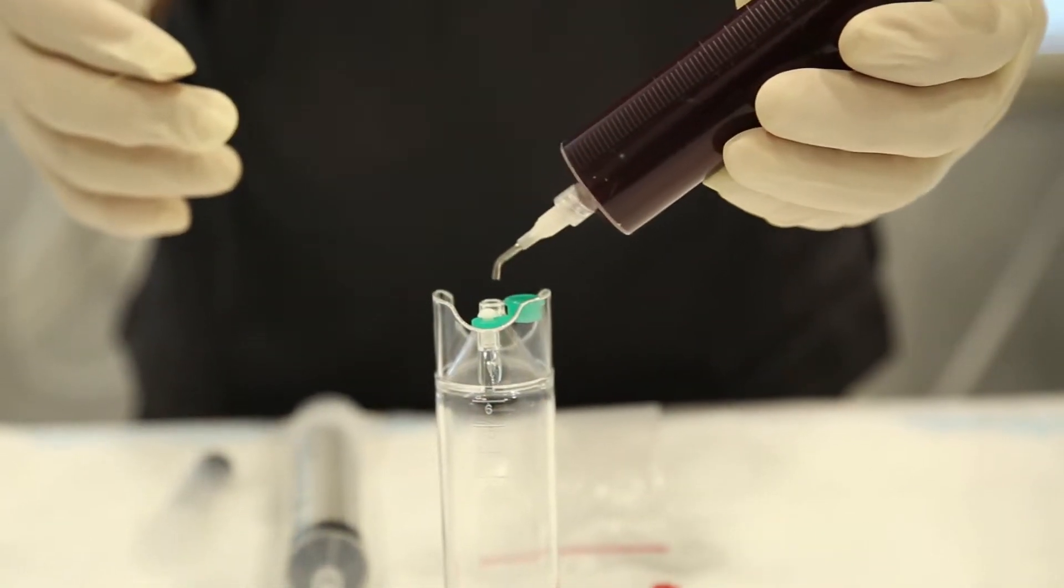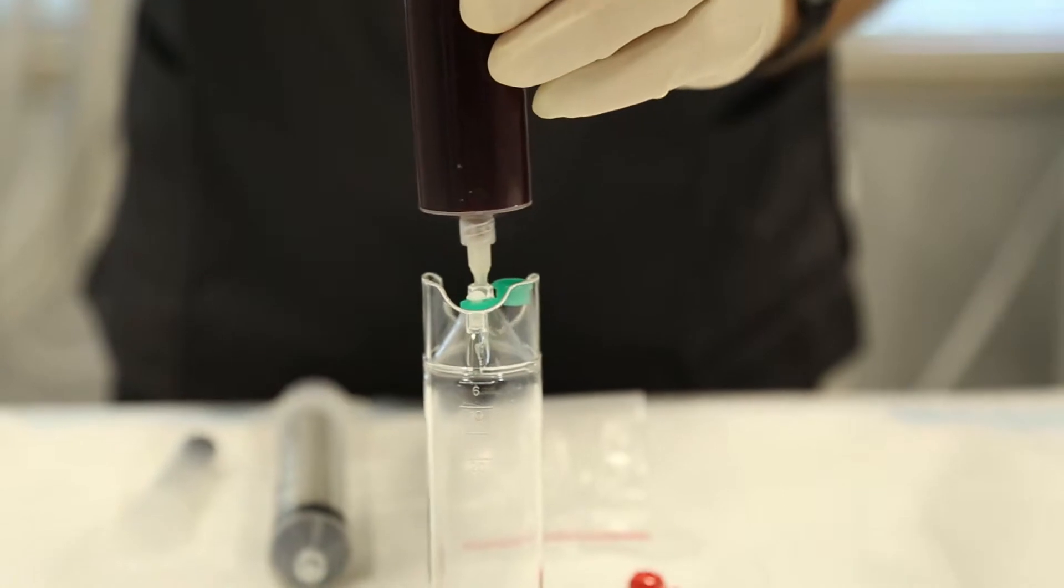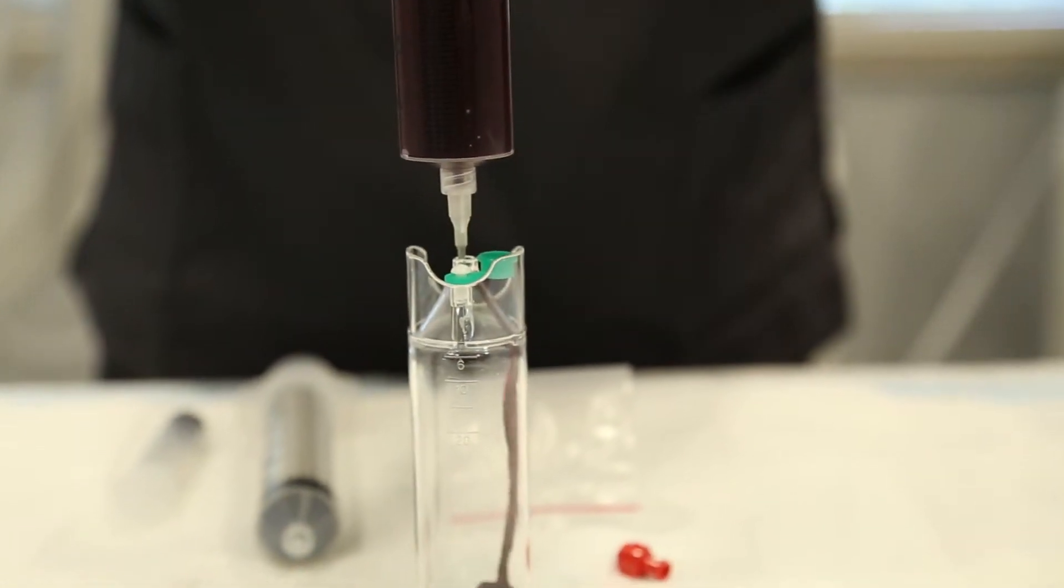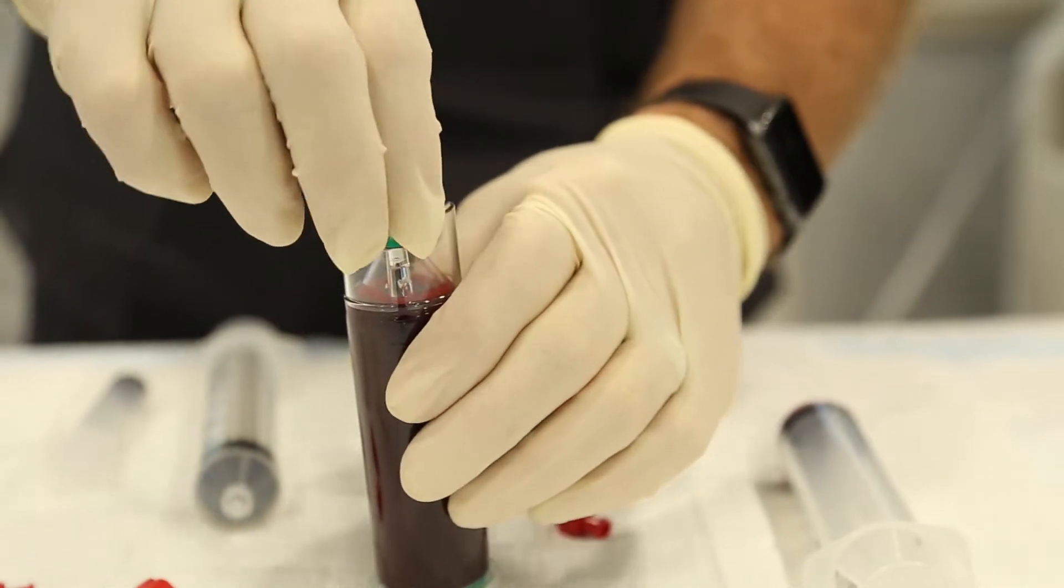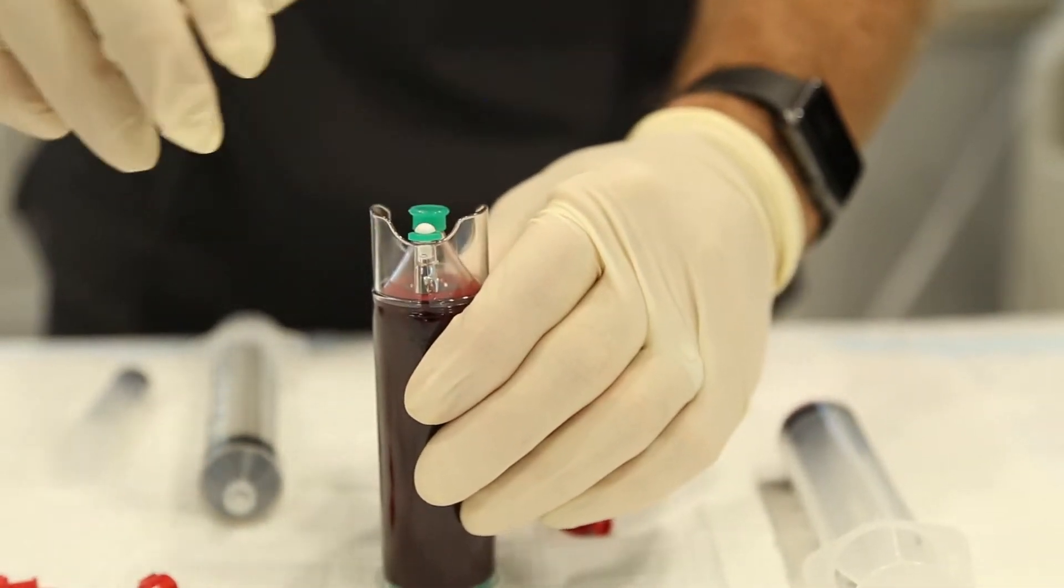Using the 45 degree dispensing tip, slowly transfer the anticoagulated whole blood into the XL concentrating device. Secure the green silicone cap and the clear safety cap to the concentrating device.